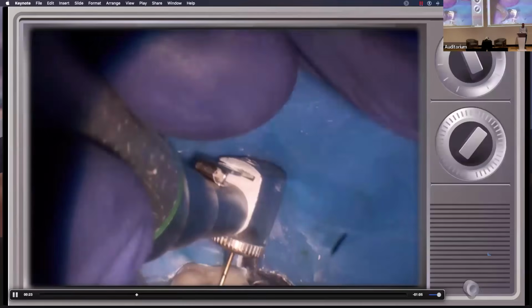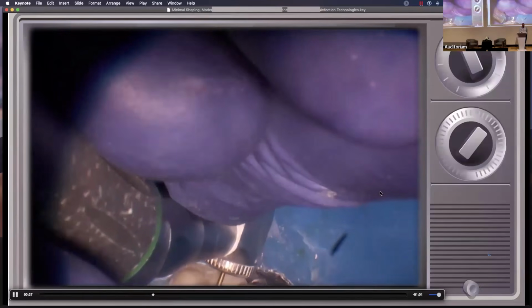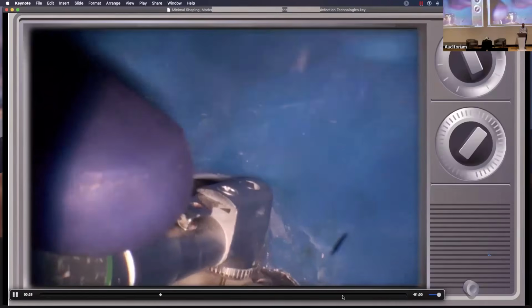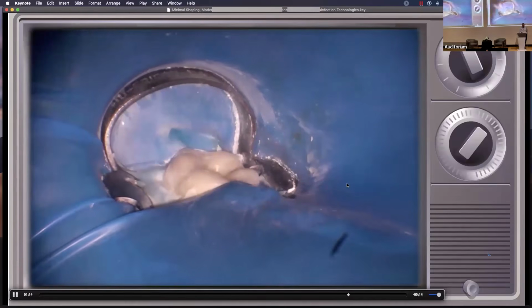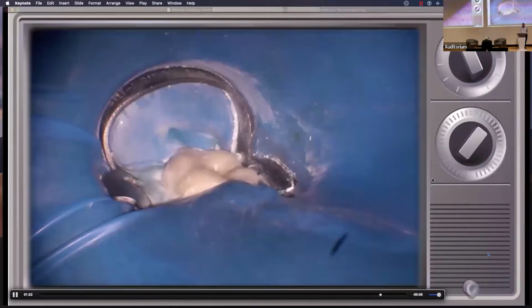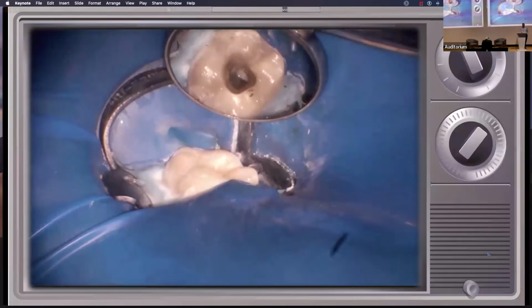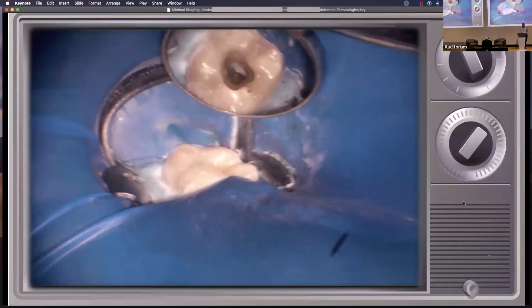Into the MB. Lift it. There's 22. 23. So the 10 hand file went, the 1002 followed, the 1702 followed, and then the 2002 followed. We did a little funneling with the 1004, but we're basically done with files. Done with files. So that's the routine.